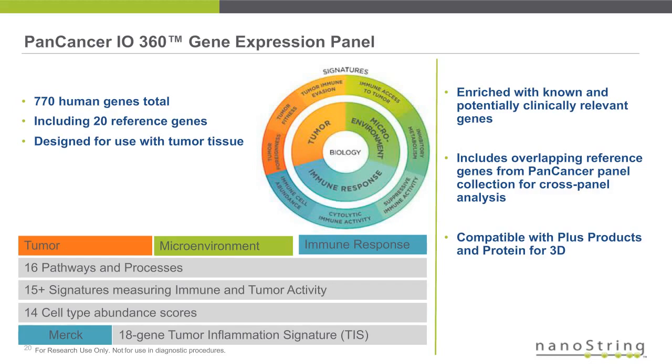So we've provided annotations about each of the genes that are in these panels. We've also provided the signatures as well as particular subsets of signatures that enable immune cell profiling. And I'm going to give this presentation over to my colleague, Dr. Danaher, in just a few minutes, who will tell you more about what each of those signatures are and what they can do.